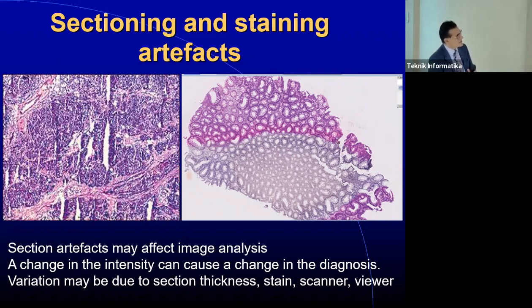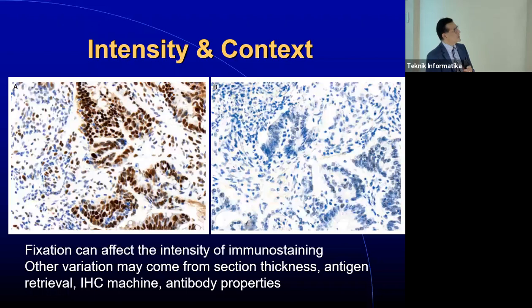But because of this, you can see a lovely boundary here, around the edge of the water droplet probably, that the staining uptake is different here compared to that. And that is just an artifact. That tissue shows one diagnosis only, but the color scheme makes it look like there are two different things going on here. Okay, so that's a little bit more depression.